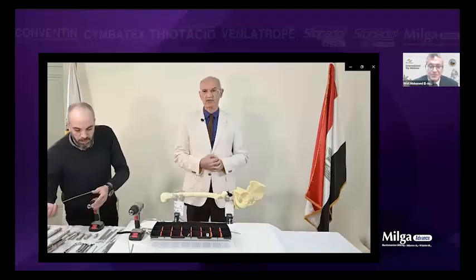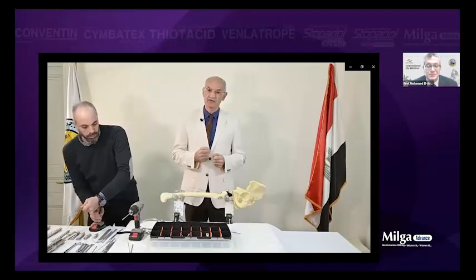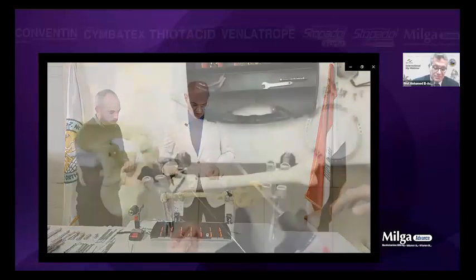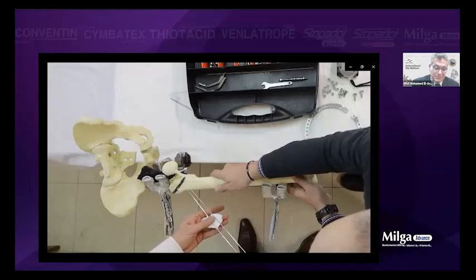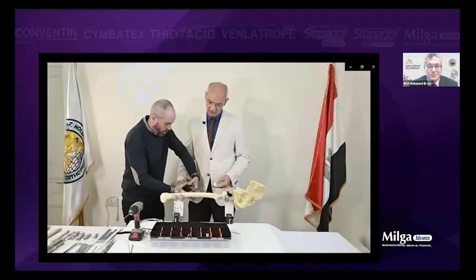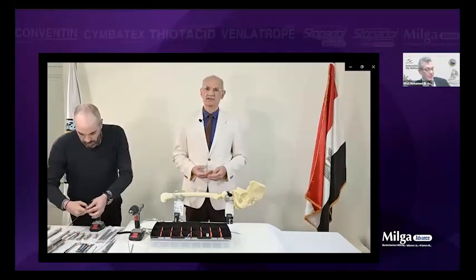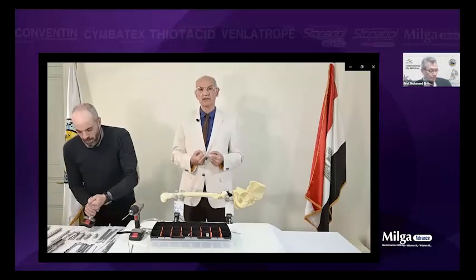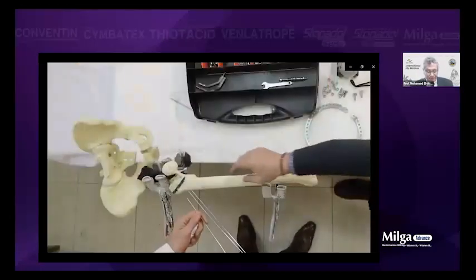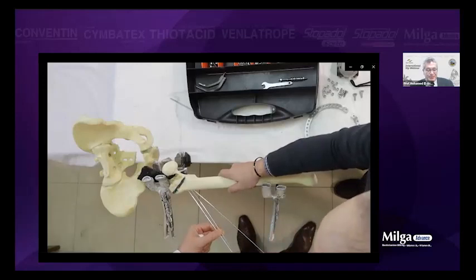Remember, some patients with trochanteric fractures or neck femur fractures have very osteoporotic bone. So you have to go till you catch with the serrations like this one. You see, this is the second one. You take the anteversion. You can use the image intensifier. This is the second one. Third one. These are 2 millimeter wires. We use the third one. You need stability, so you need more and more stability. Again, you see the third one. We can go below this, and you change the direction.